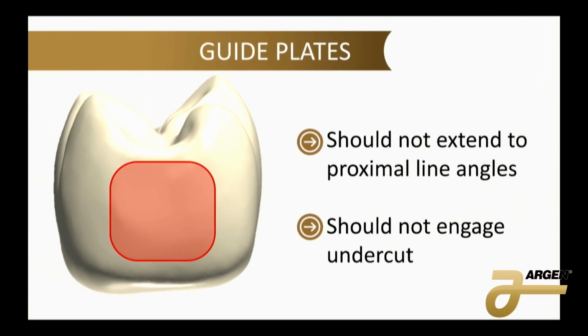So guide plates, really quick. This is more when you're speaking to your dentist. Some dentists just don't prep guide plates. They should be prepped. When they're prepping the rest, they should be prepping these. And they should not extend beyond the proximal line angles. They should be nice and flat.